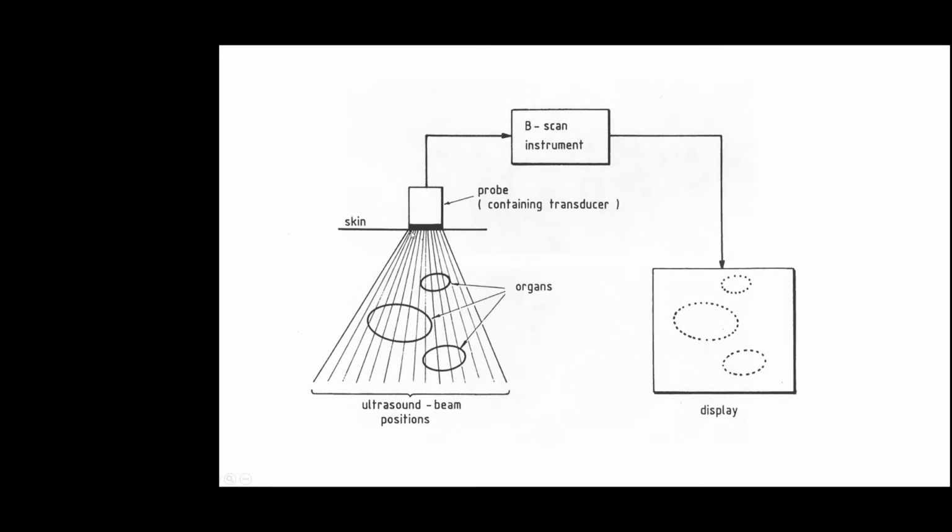If we do that for many different lines with this two-dimensional transducer, which can produce the ultrasound beams at different angles, then we can take all these lines together and form an image. This is basically as simple as it is. Of course, there is a lot of signal processing, and tricks and tools to improve the quality of the image, but the basics are just like this.